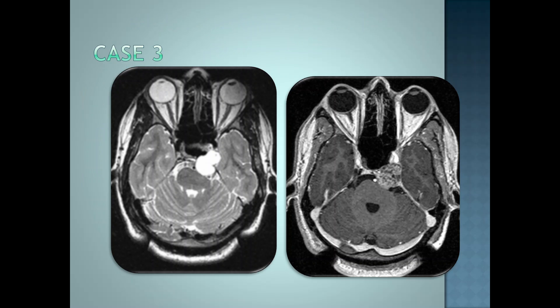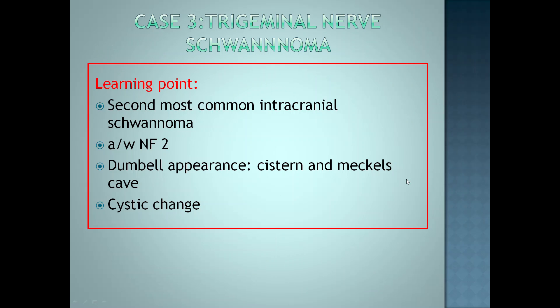Third case: we see an abnormality in the left CP angle cistern. There is a lobulated dumbbell-shaped lesion extending into Meckel's cave. It is markedly T2 hyperintense with heterogeneous enhancement. This is a trigeminal nerve schwannoma.